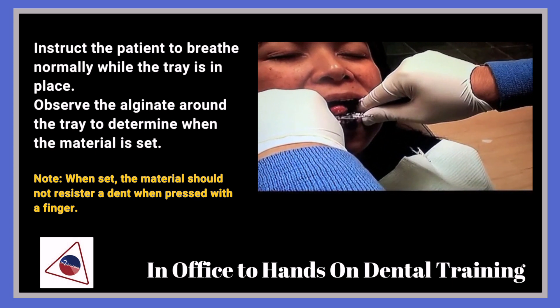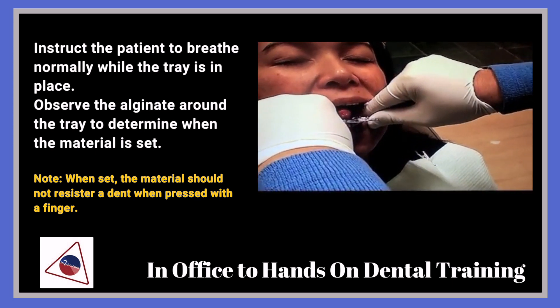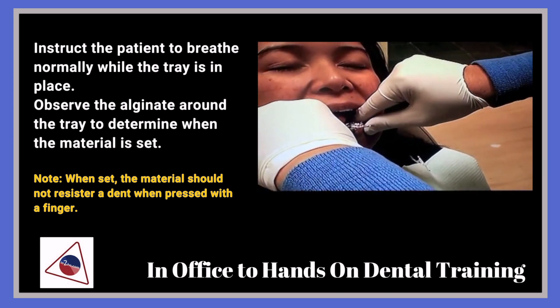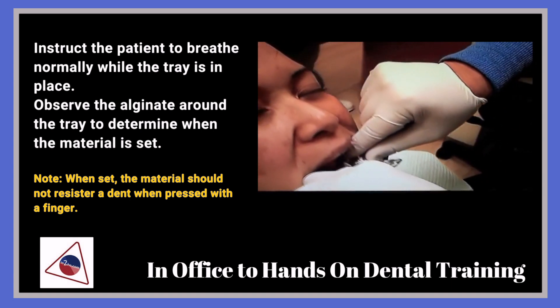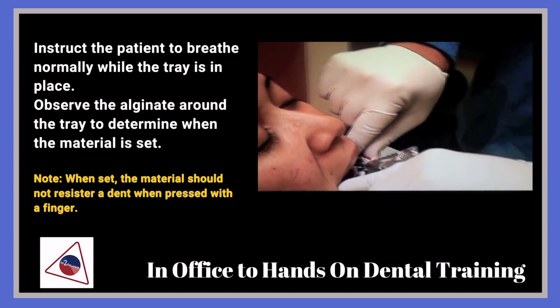While you're holding that, you can go ahead and start mixing the upper. If there's another assistant, you can have that person start mixing.